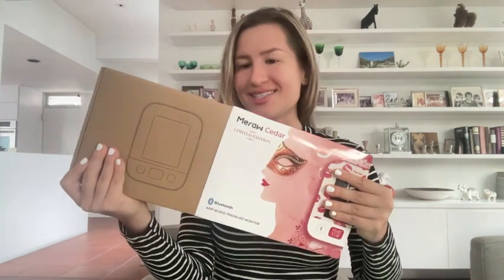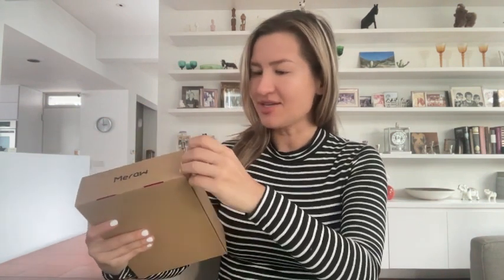Hello everyone, my name is Olga Van Light and today we are going to unbox the Meraw Cedar limited edition blood pressure monitor that you can actually connect to your phone because it comes with an app. I feel like it's definitely a great gift idea as well, and it's packaged very well — look at that!